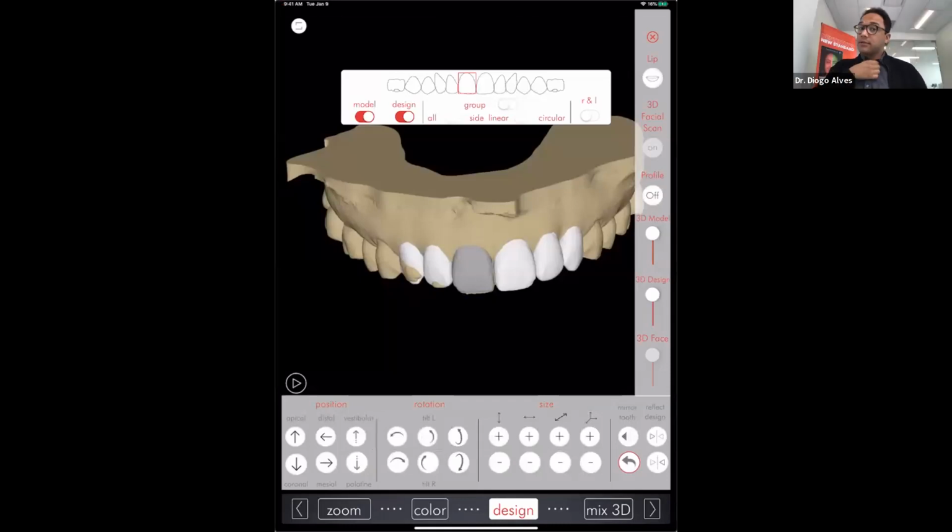Yeah. Most of the time we have a great communication, a great relationship with our dental technicians. But they also have their own workflow, and sometimes you ask them to just make a few changes, and it takes 3 days, 4 days. Right.